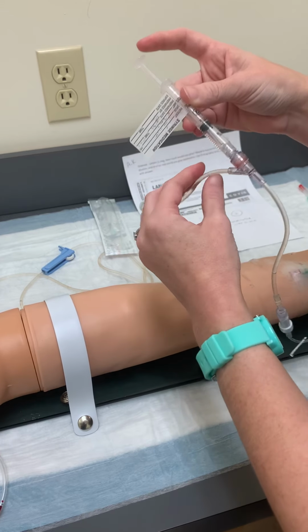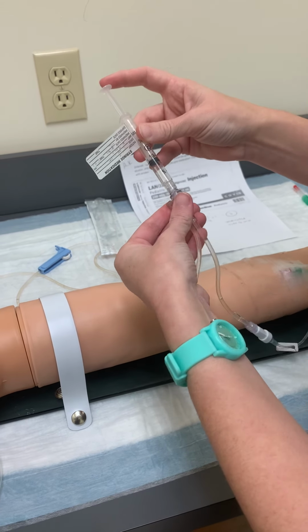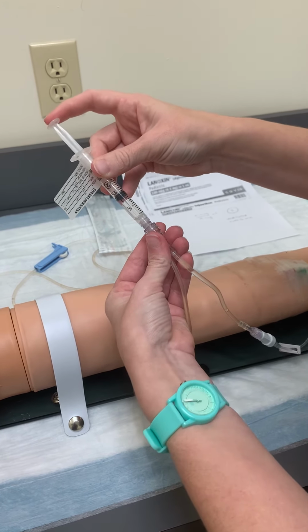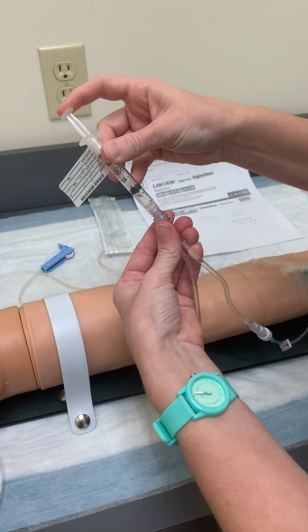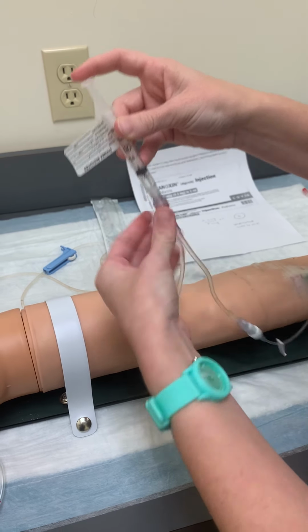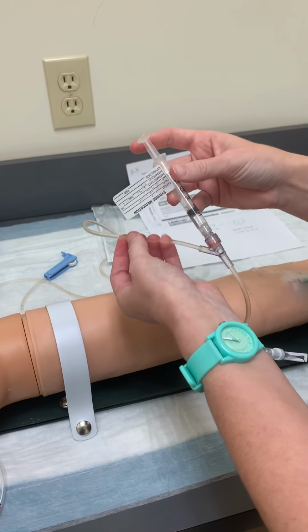Okay, I'm back at 12, so I'm going to clamp off behind and push another 0.4. 1, 2, 3, and 4. And open it up and let it flush.